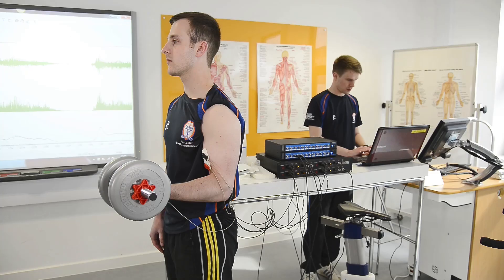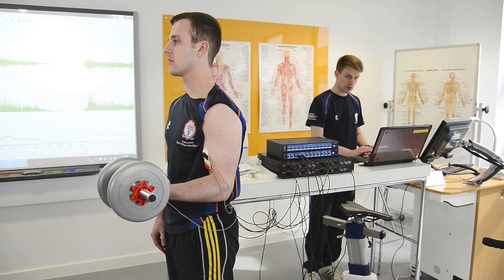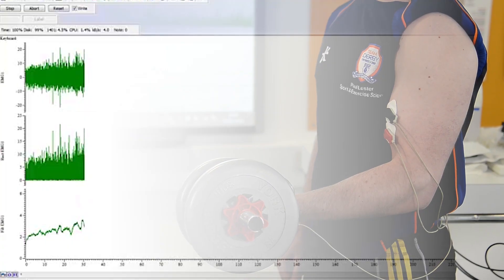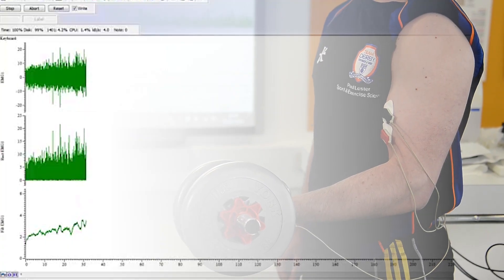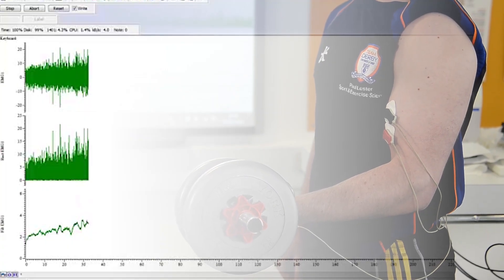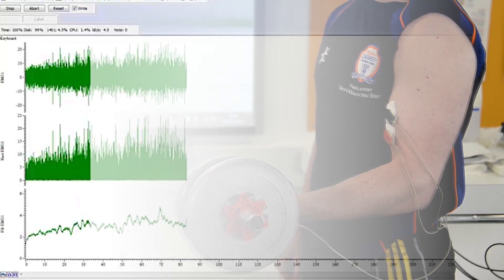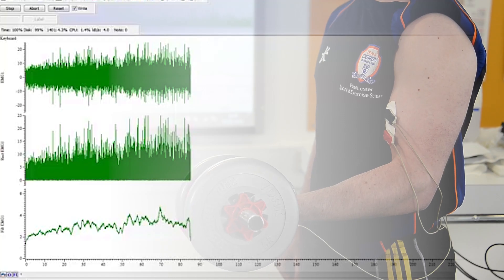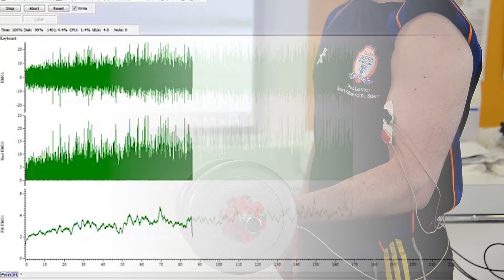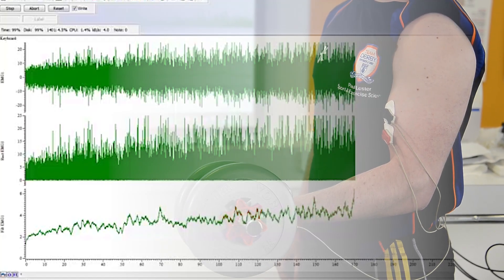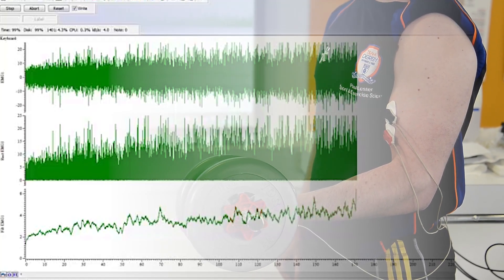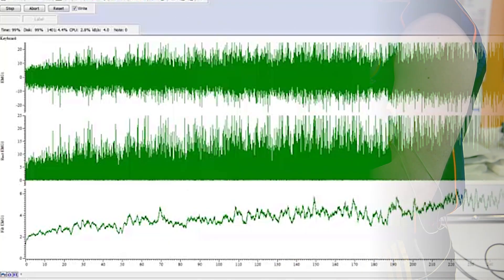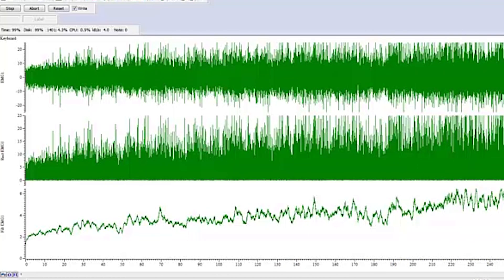Sport scientists may also use EMG to measure muscle fatigue. If Paul holds a weight for a prolonged period of time, the EMG is initially stable, but then increases as he fatigues. He needs to recruit more and more motor units to maintain that force. This is just one way in which EMG changes during fatigue.